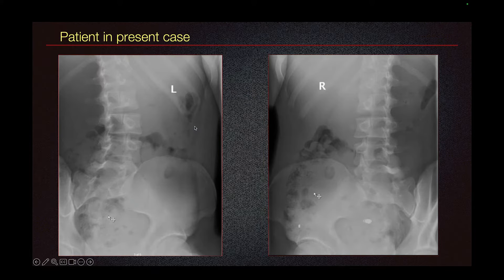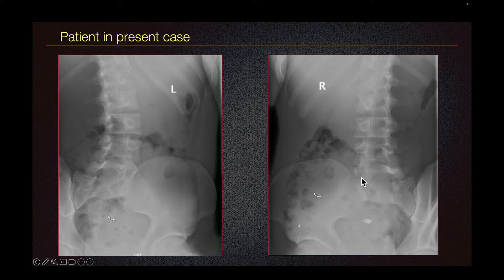These are oblique radiographs of the spine. On the left, we do see this lucency that corresponds to an L5 pars defect. On the right, we do see this lucency as well, but there is overlying bowel gas, and it is unclear if this is just overlying bowel gas or actually a fracture.